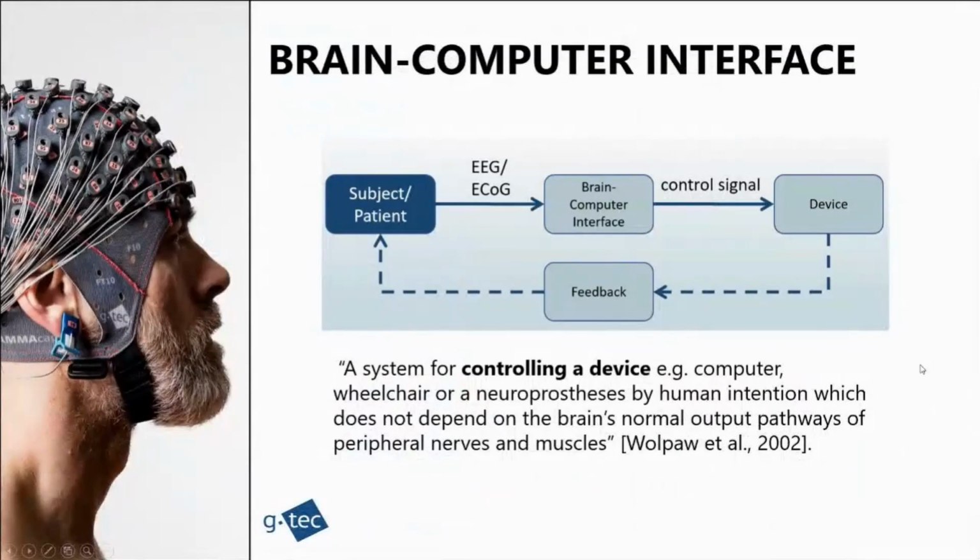For some of you not really familiar with brain-computer interface BCI, I will give you a brief introduction. What we're doing here is measuring the signal from a subject. It could be EEG, what we are using for today's demonstration. It could be ECoG, which means open brain mapping, which requires open surgery of your scalp, then placing an electrode grid to measure the passive signal from it. But we are not doing that because of the requirement to do it in a field hospital.